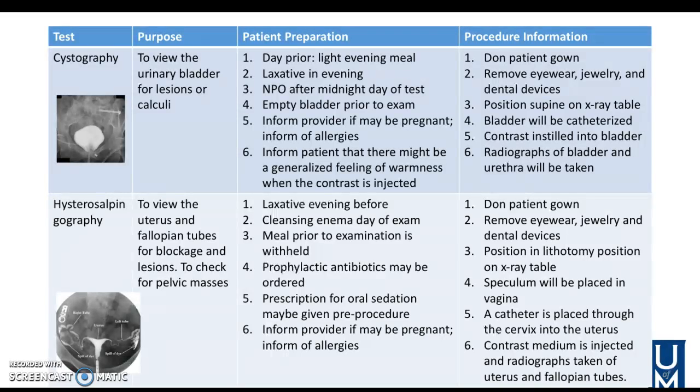They may be given some prophylactic antibiotics just in case. So prophylactic just means they're given it just in case they introduce any type of bacteria during the testing procedure, just because this is a very internal structure. Prescriptions for oral sedation may be given. Opening up the cervix is very painful, so they may be sedated for this test. And then they're going to inform the provider if the patient is pregnant and if they have any allergies to those contrast dyes.